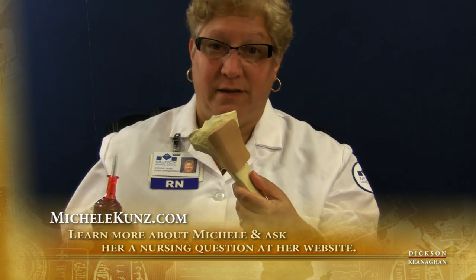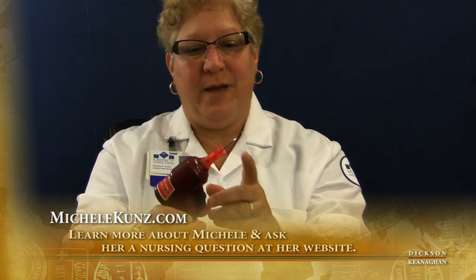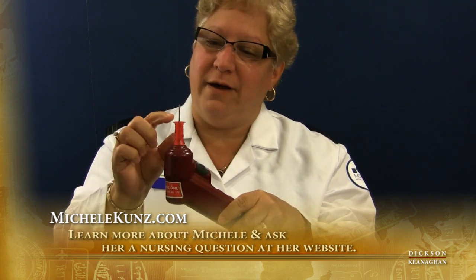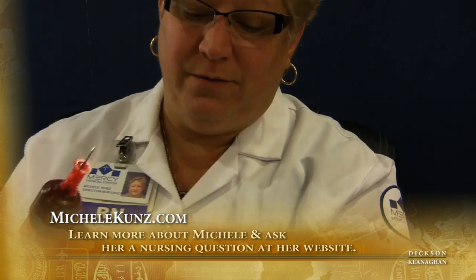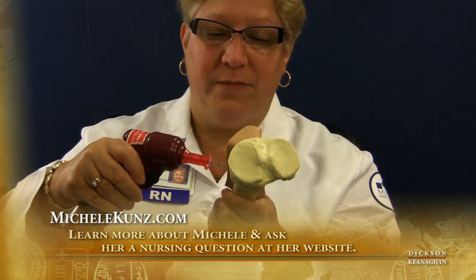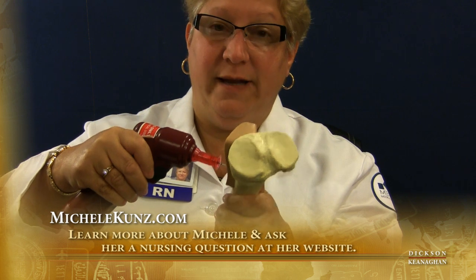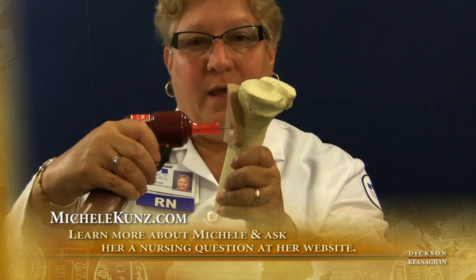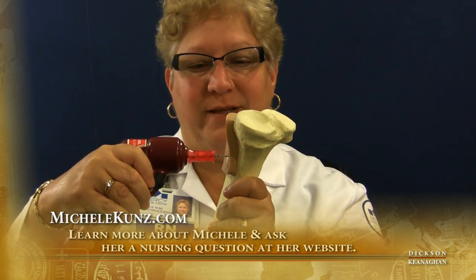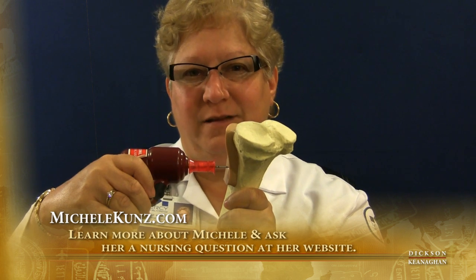I've made sure that myself or the team has cleaned the bone. I'm going to take the cover off the needle. You can see the two lines on the needle. The rule with the lines is that you're supposed to feel the flat surface of the bone, keep it as clean as possible, and push the needle in and hit the bone. If I see a black line left on the needle, I know I still have enough needle length to get into the marrow once I drill.